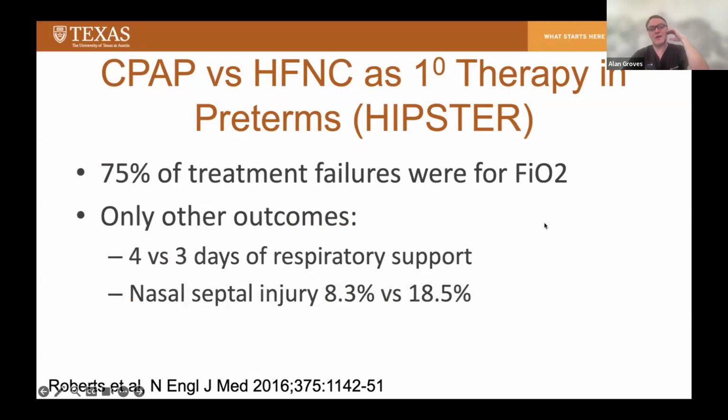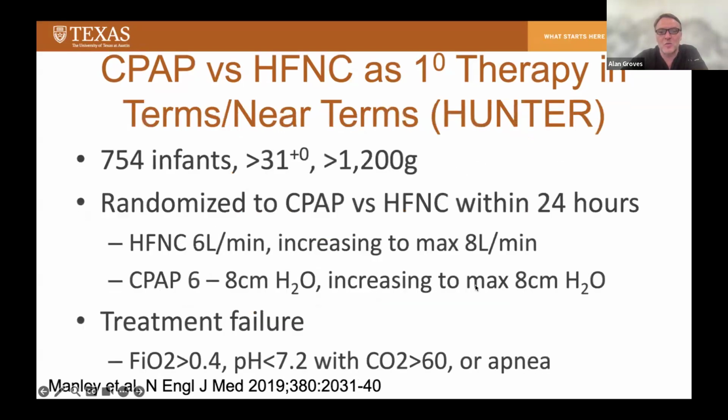The majority of the treatment failures were for FiO2 rather than blood gases, and otherwise in the outcomes, there wasn't a big difference in days of respiratory support, 4 versus 3 days, so a slight difference. There was quite a big difference in nasal septal injury, with the rate being twice as high in the CPAP group. Hunter trial, very similar design, just slightly bigger babies.